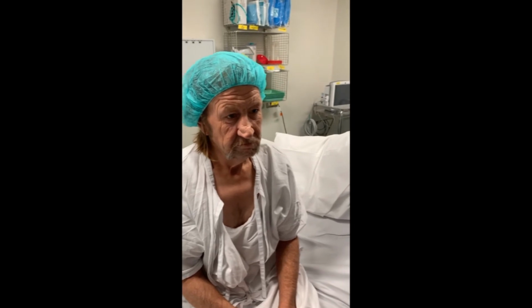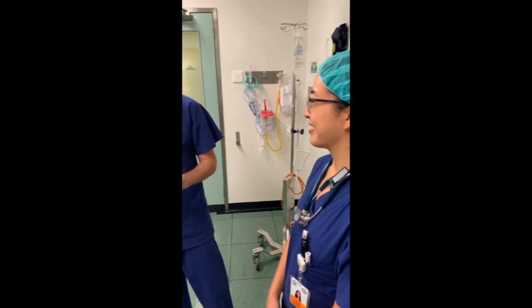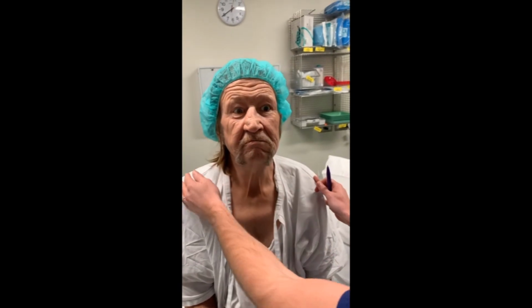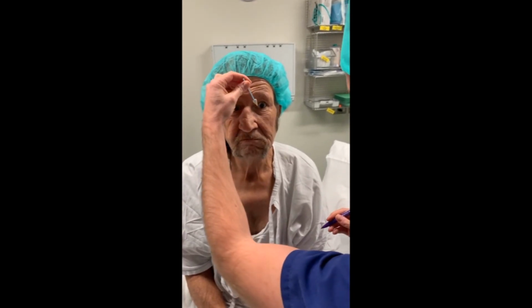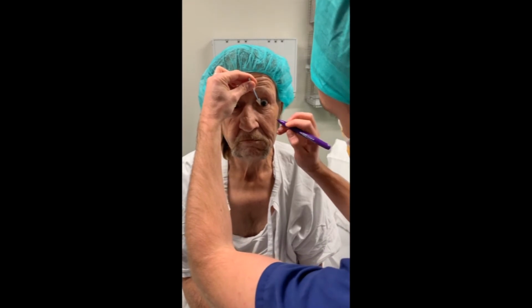If you just stand a little bit further back there and then just hold an index finger up, that's great. Nice and kind of there, that's great. Chin up a bit there, Eric. Nice and straight. That's brilliant. Well done. Okay, so eyes wide open. That's really good. I'm just going to come pretty close, but just keep nice and steady.